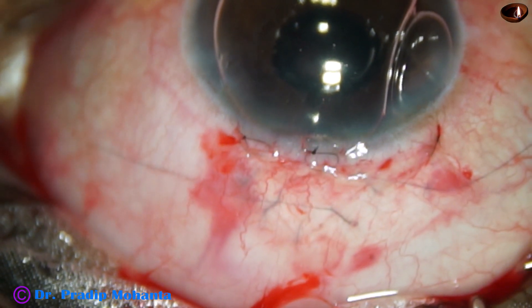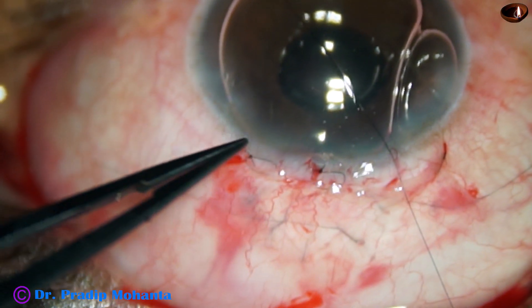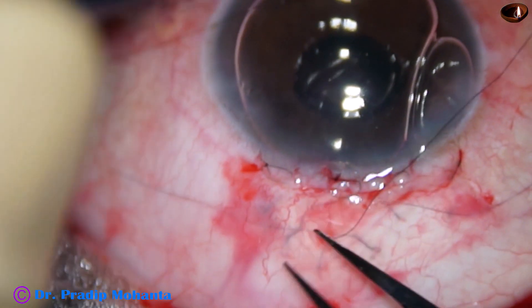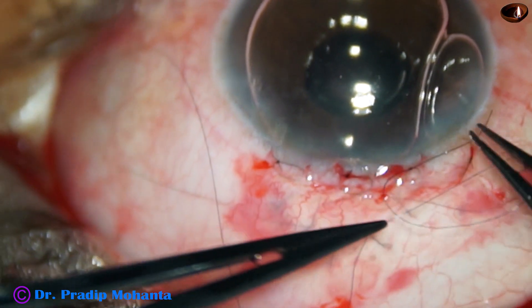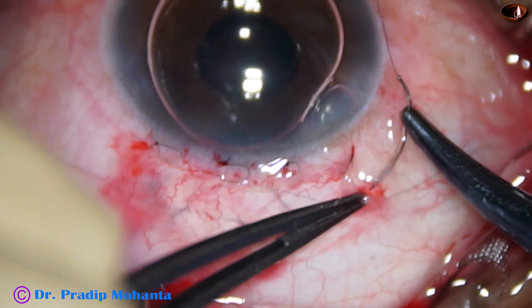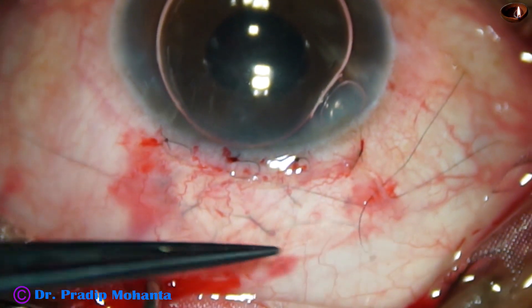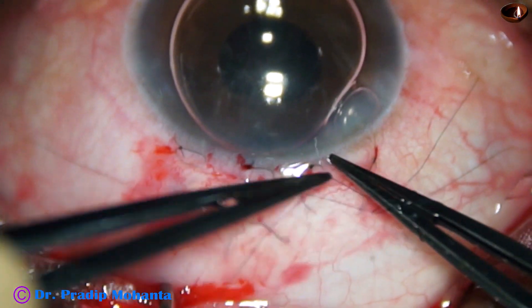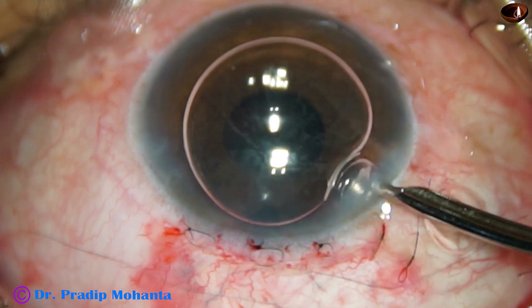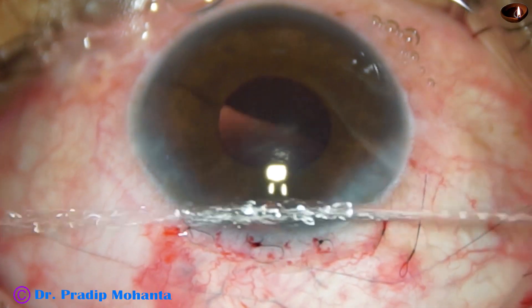Now this is the third mattress suture. See how beautifully the conjunctiva is opposed to the limbus. And now one more suture is placed here — this is going to be a releasable suture. Releasable suture means just three loops and pull, and cut. And now the air bubble is removed. This is the final lavage of the anterior chamber. The air bubble is removed and the anterior chamber is formed by balanced salt solution. And the case is concluded.